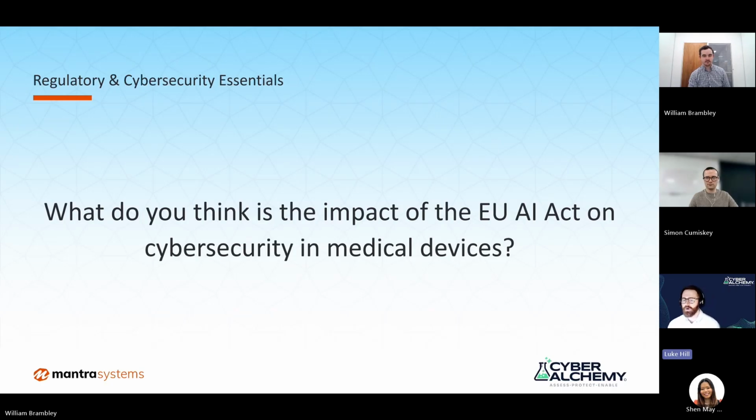But one thing I did think was quite interesting is the logging and monitoring and human oversight there as well, right? So introducing robust logging and monitoring is really important. If a clinical decision is made or anything else like that, then you've got an audit of what was input into the AI, and then what was output from the AI, and you can see that full auditable trail. That oversight should be high up on people's priority list with those sorts of things.